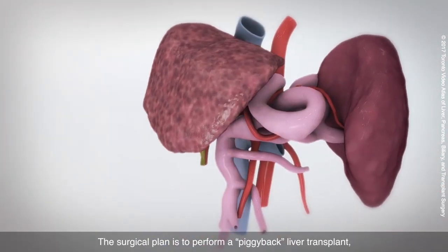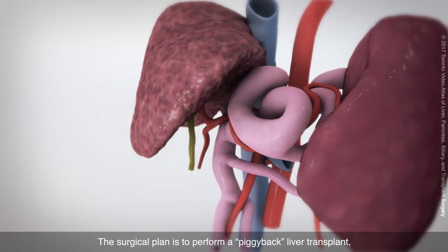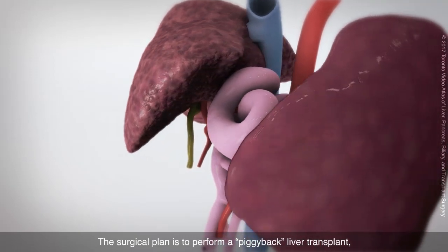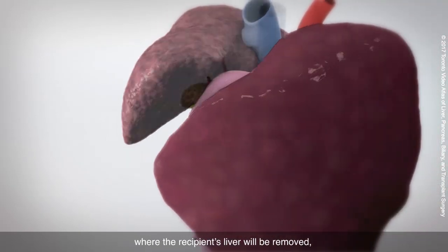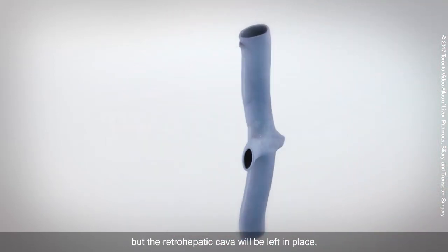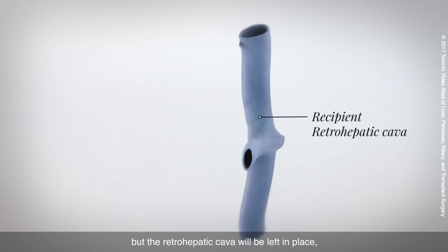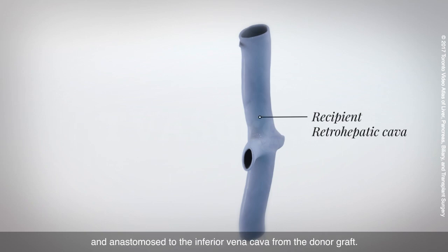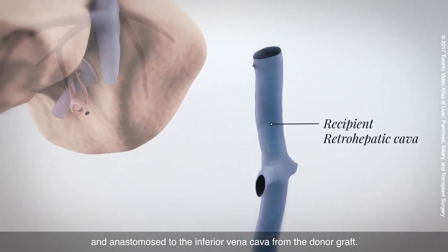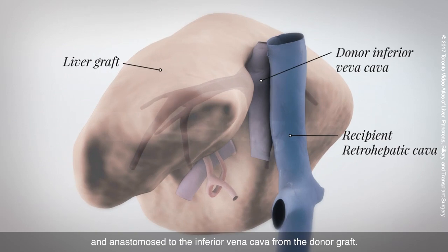The surgical plan is to perform a piggyback liver transplant where the recipient's liver will be removed but the retrohepatic cava will be left in place and anastomosed to the inferior vena cava from the donor graft.